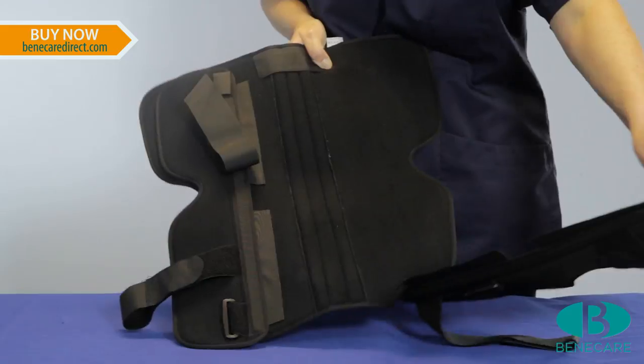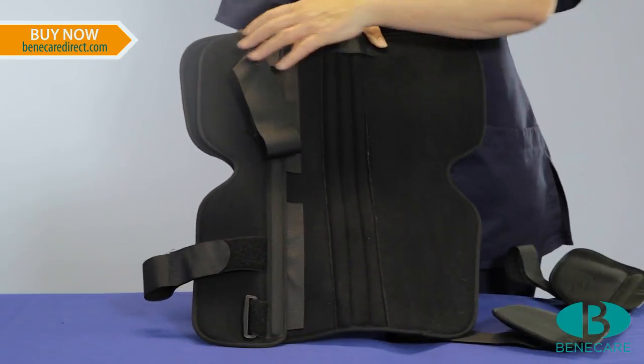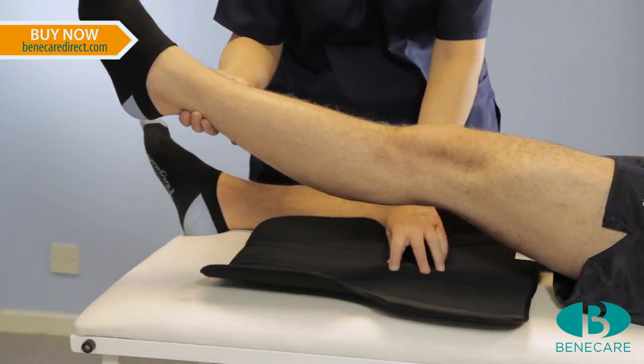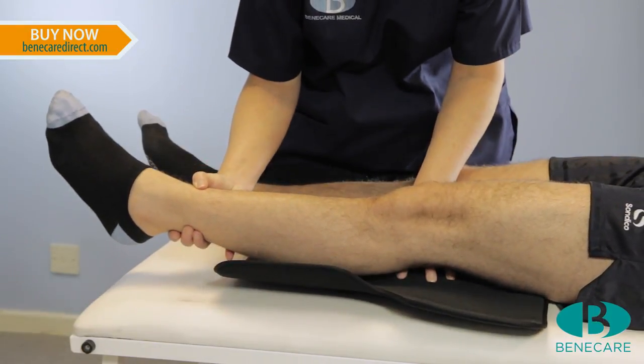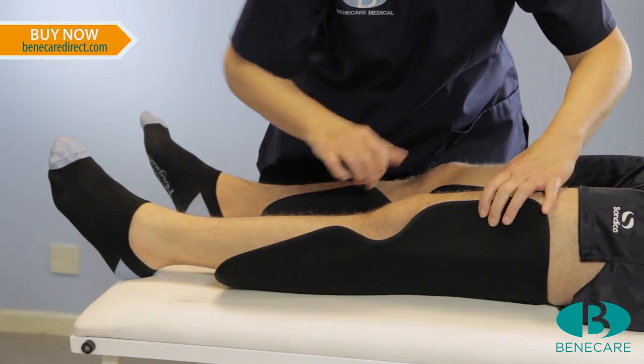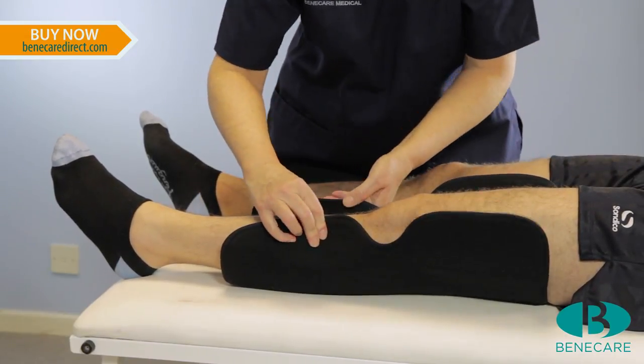Remove the posterior panel from the side panels. The posterior stays are contoured to fit into the fossa at the back of the knee. Ensure this is positioned and fitting correctly before attaching the side panels.